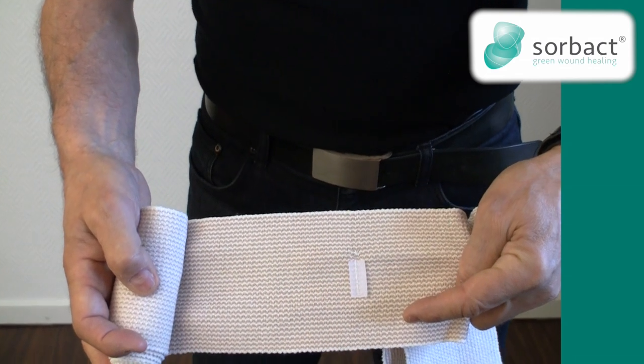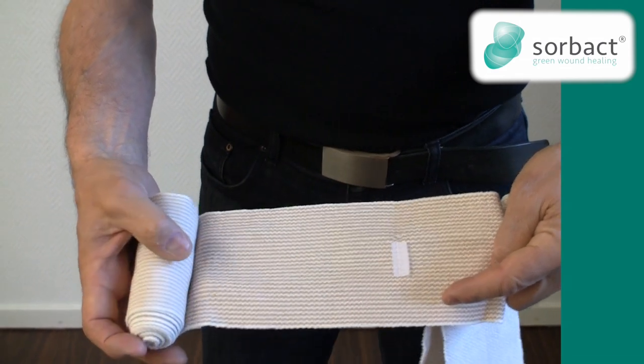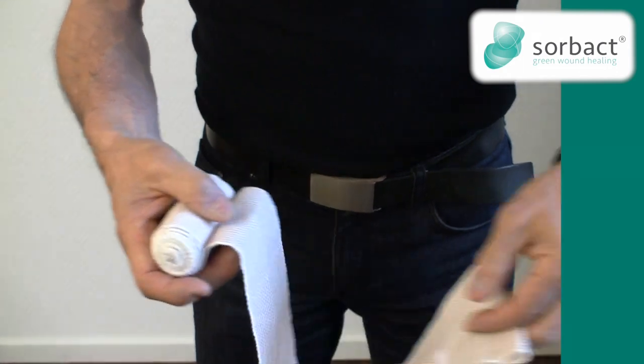Within every 50 cm there is a little piece of Velcro that will help you to fixate the bandage.